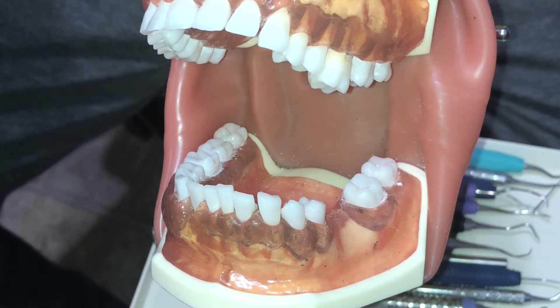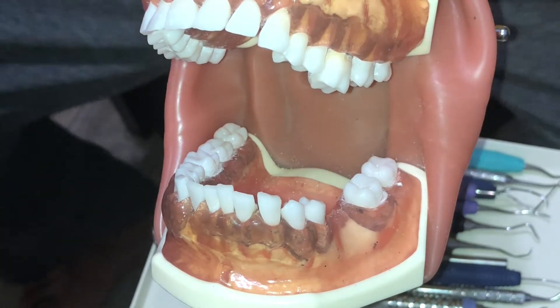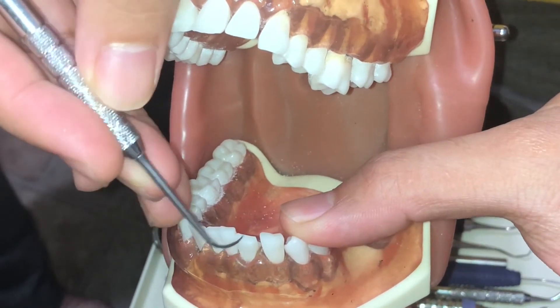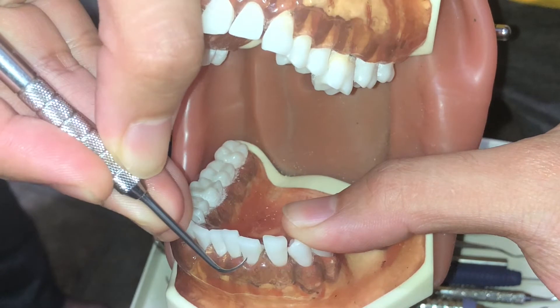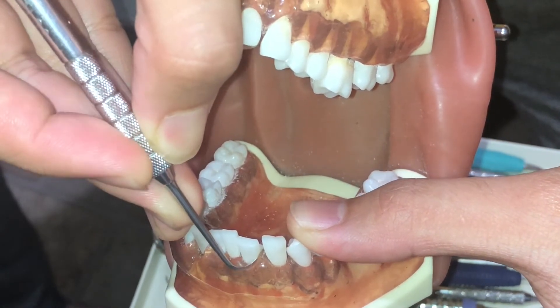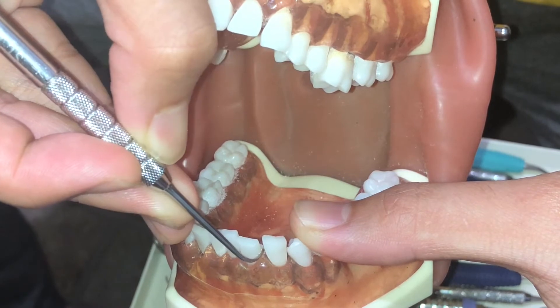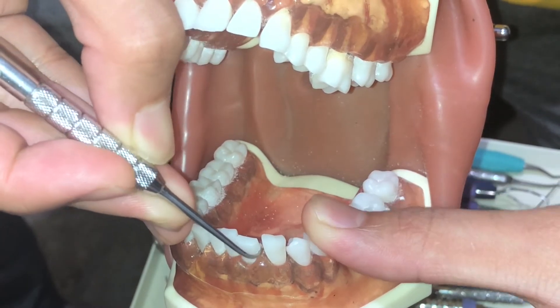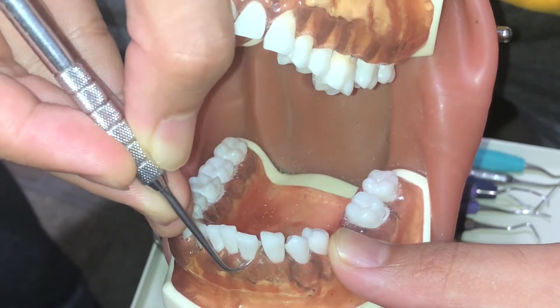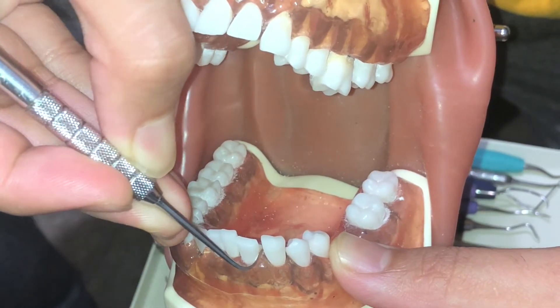Using a sickle, I'll be instrumenting the distal facial of number 23. I have my anterior sickle scaler here. First, I'll go to the ready position, then activate my strokes, making sure I'm adapting on the line angle.